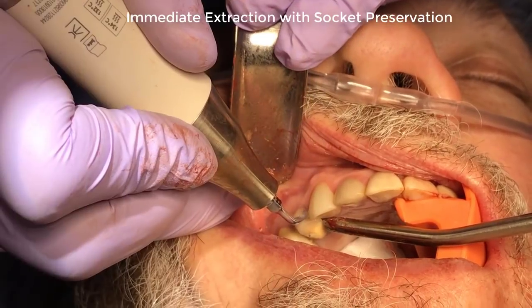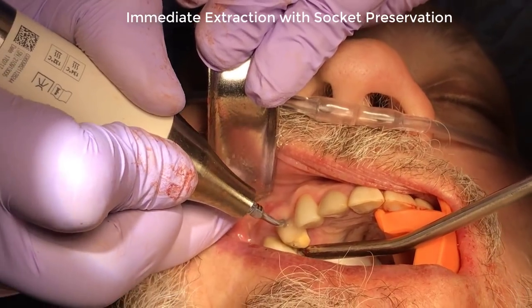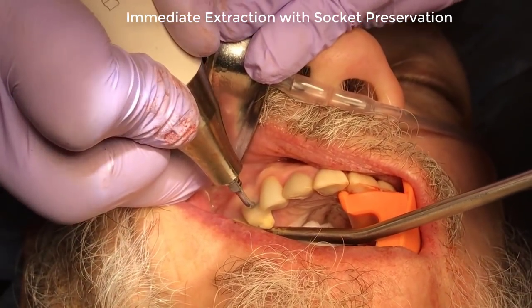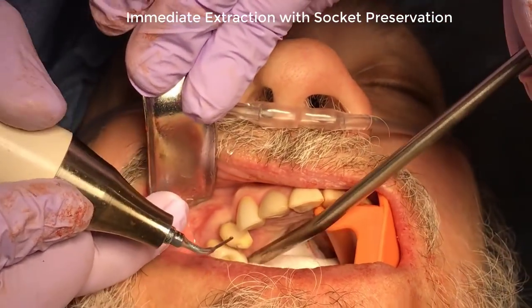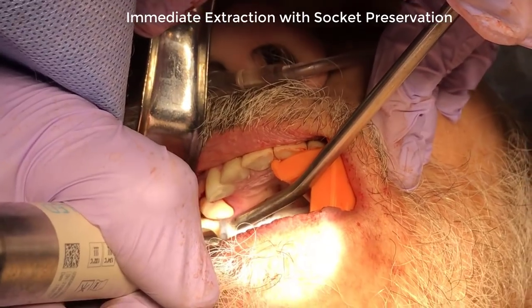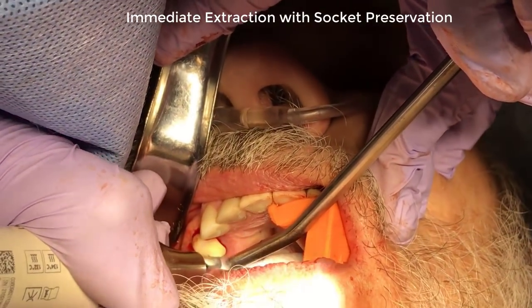Here's another technique we're using — we're using the LC2L and the LC2R on the mesial buccal in this area. This patient has very dense bone, as you can see, but we're directing the tip apically and just performing these vertical osteotomies and returning the tip out to allow it to cool. We'll use the same tip on the mesial buccal as we do on the distal palatal or the distal lingual, then we'll change tips one time and use it for the distal buccal and the mesial palatal or mesial lingual, depending on the quadrant you're in.